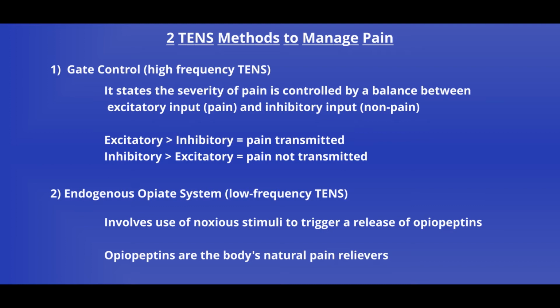Low-frequency TENS uses motor level stimulation that is uncomfortable for the patient. The noxious stimuli triggers the body to release its natural painkillers. The release of opiopeptins then helps modulate the level of pain the patient is perceiving.